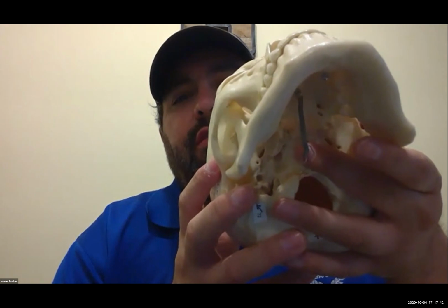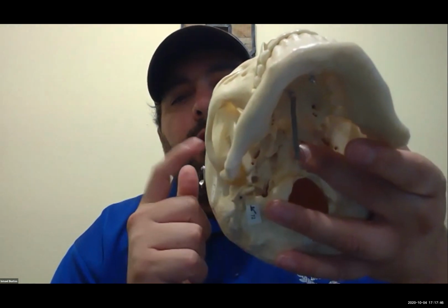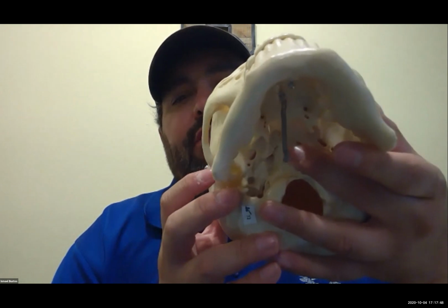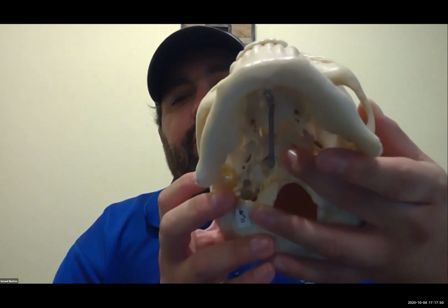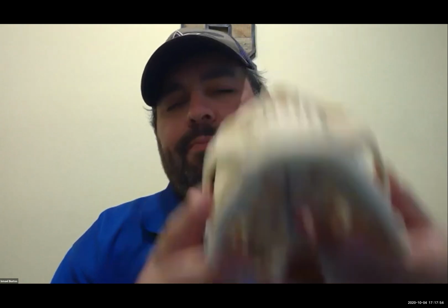So if I don't tilt enough, it stays superimposed over the parietal bone. If I tilt it just enough, I can see it, but if I tilt too much, now it's superimposed over the mandible, okay? So if you have it superimposed over the parietal bone, that means that you did not tilt enough. If it's superimposed over the mandible, you tilted too much.